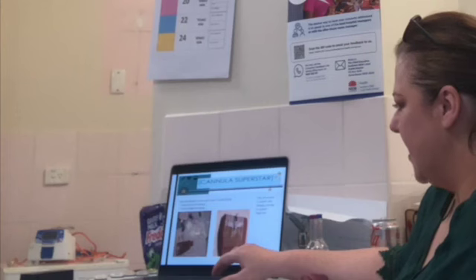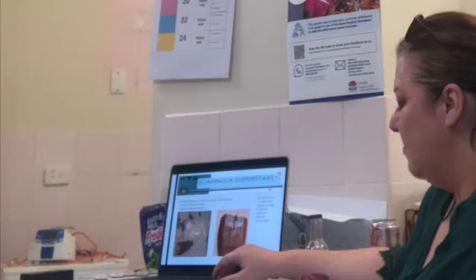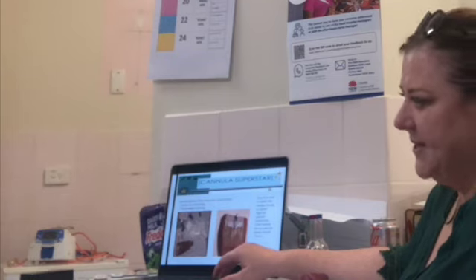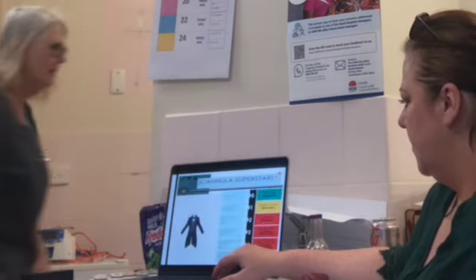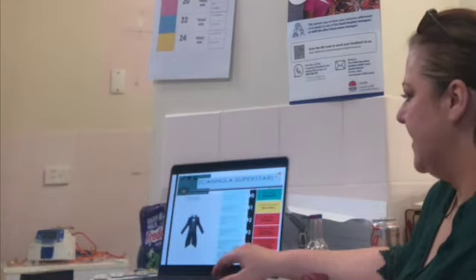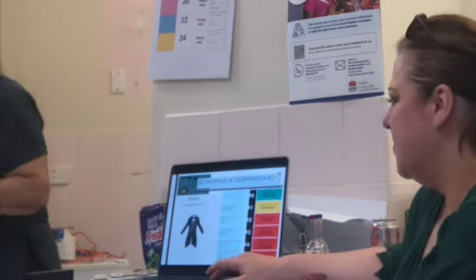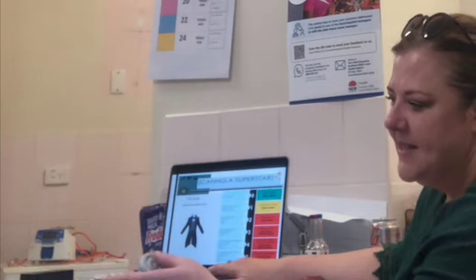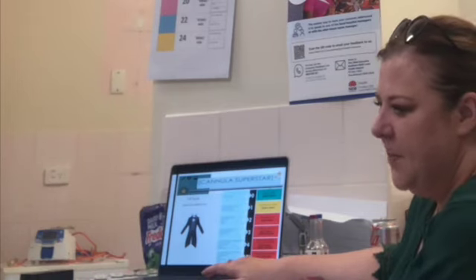And changing the dressing, think about fragile skin, moist skin, pressure areas. Who can replace the cannula if you need to, and a VIP score. Alright, so VIPs. It's the visual infusion phlebitis score. So I think there's some loose leaf where you can see the VIP score a bit easier.